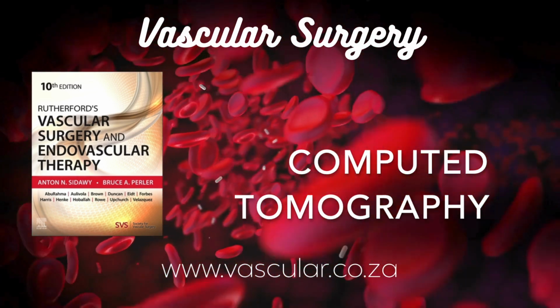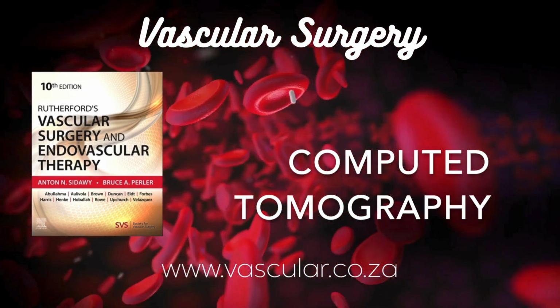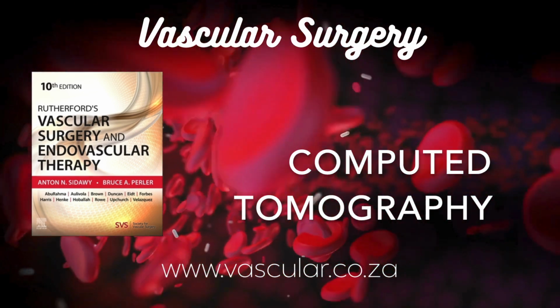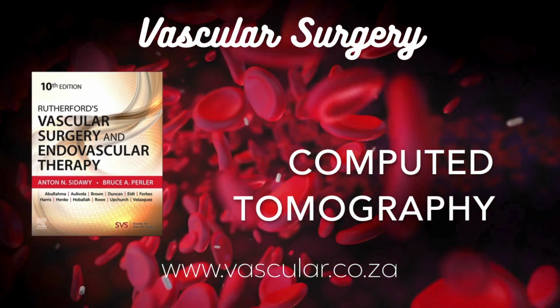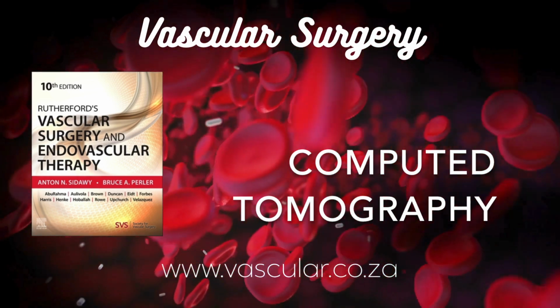But still, these are 3D models on a flat 2D screen, right? That's the inherent limitation. True depth perception is tricky. There's specialized viewing software, even some experiments with actual 3D monitors trying to overcome that, but standard viewing is still 2D projection of 3D data. Okay, this is incredibly powerful tech. Let's pivot to clinical applications.